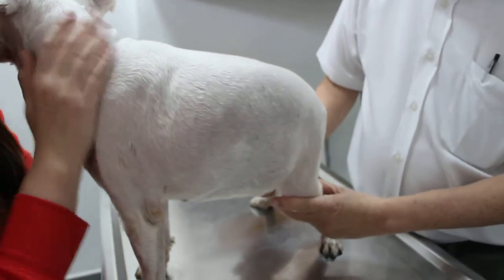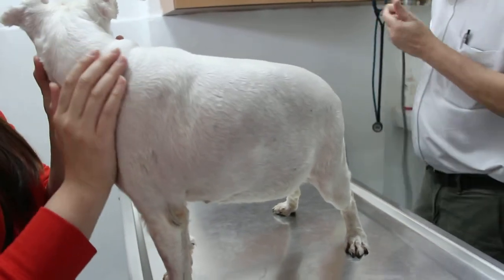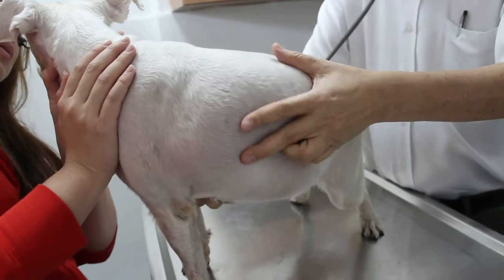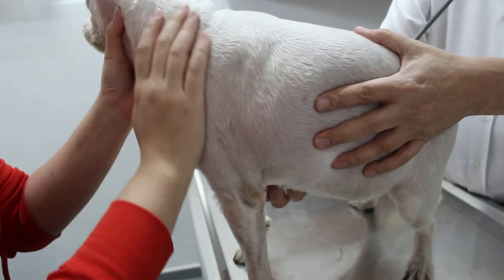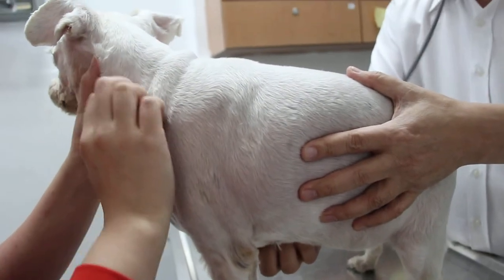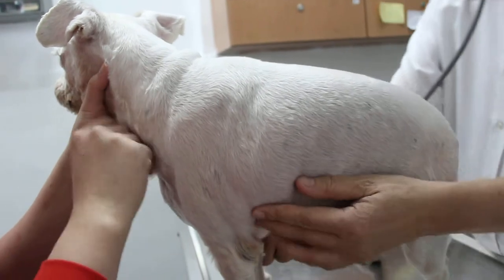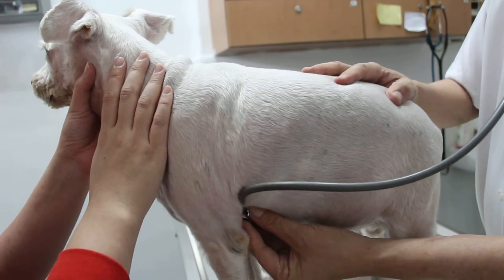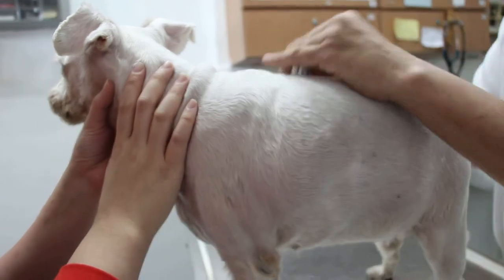See whether there's any stone in the kidney. What I will do is x-ray the dog. But before that, I will check the heart first — see whether there's any abnormal heartbeat or heart problems or heart disease. Is the dog coughing? No, never coughs. The heart rate is okay. The lungs — that's alright.